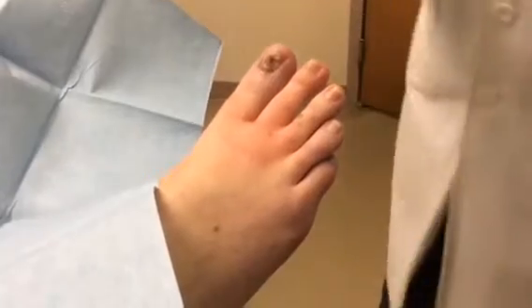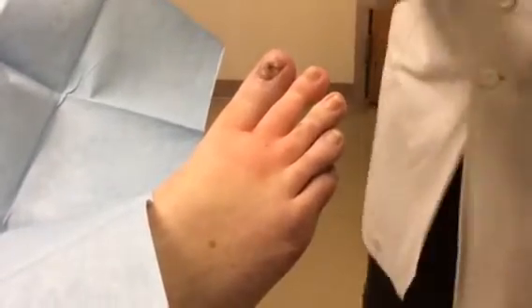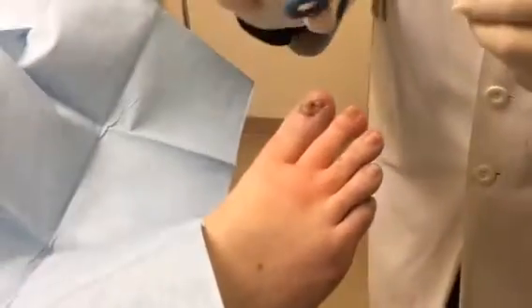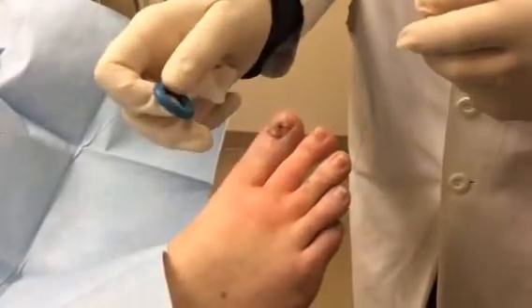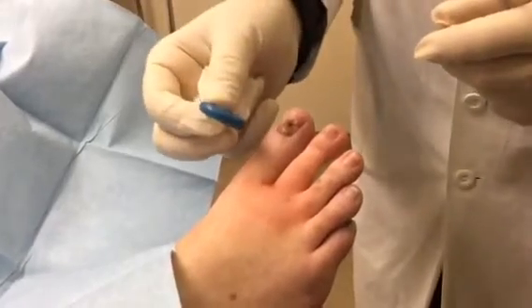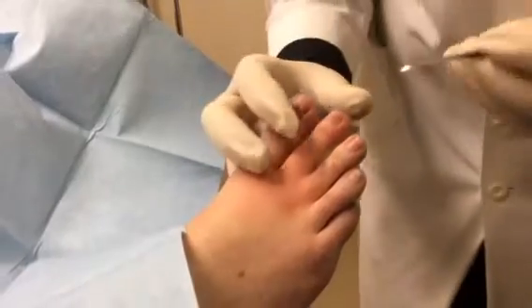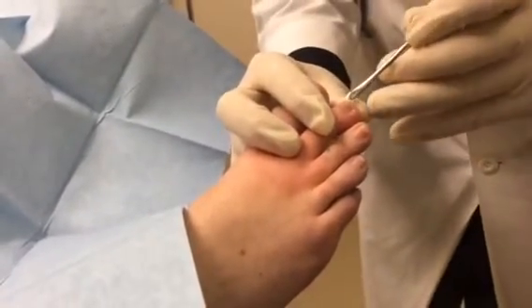So we've got the second toe numb, and we're going to do a total temporary on it. One difference is that on a temporary removal, we do not use this thing — this is a tourniquet. When you do a permanent removal, you kill the root and you cannot have the toe bleeding. This is actually made for a big toe, but I find it better to do temporaries most of the time without a tourniquet. You should feel very little; if you feel anything, let me know.